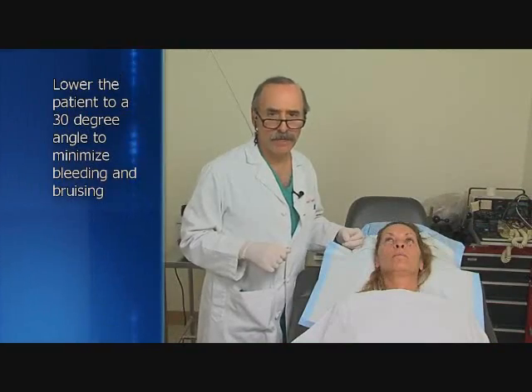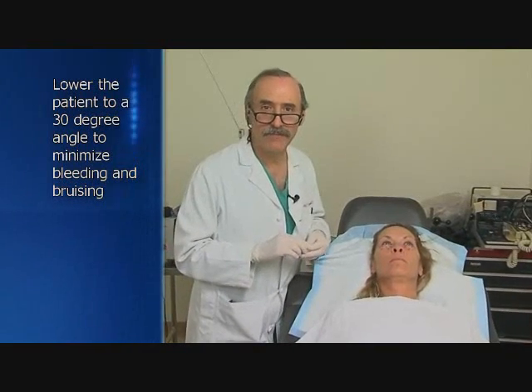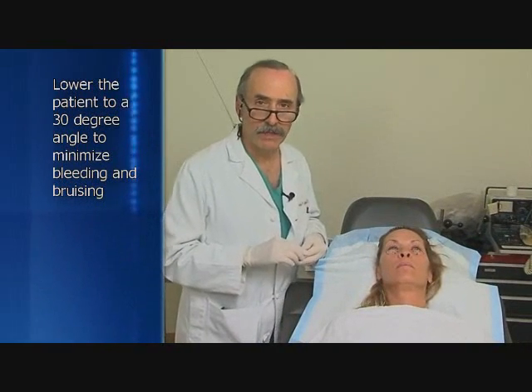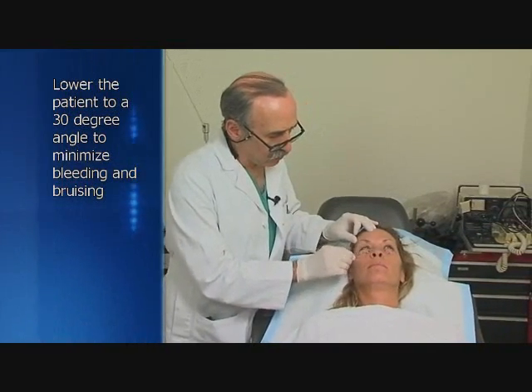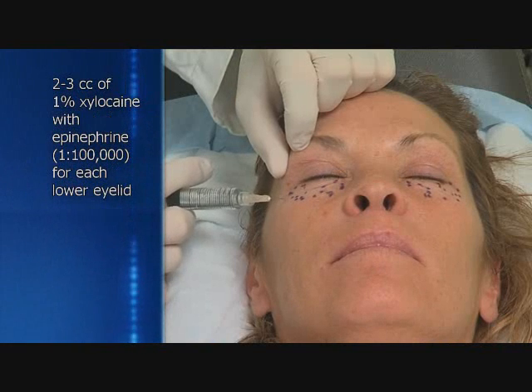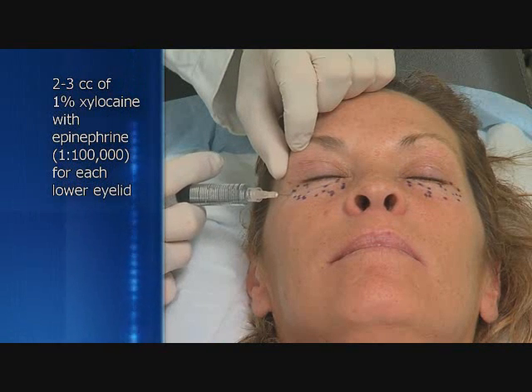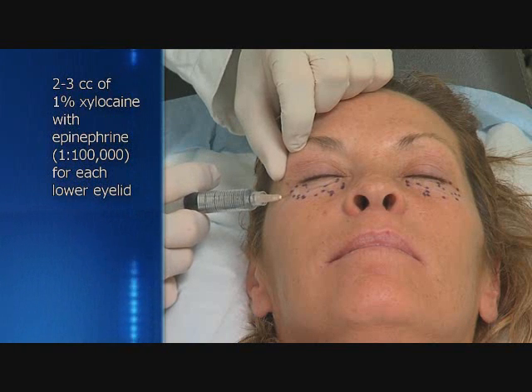The head is lowered and the patient is now 30 degrees from the horizontal. This enables the surgeon to safely perform the procedure and minimizes bleeding and bruising. Local anesthesia is applied to the lower eyelid. The anesthetic is 1% xylocaine with epinephrine 1 to 100,000. Typically 2 to 3 cc's is needed for each lower eyelid.